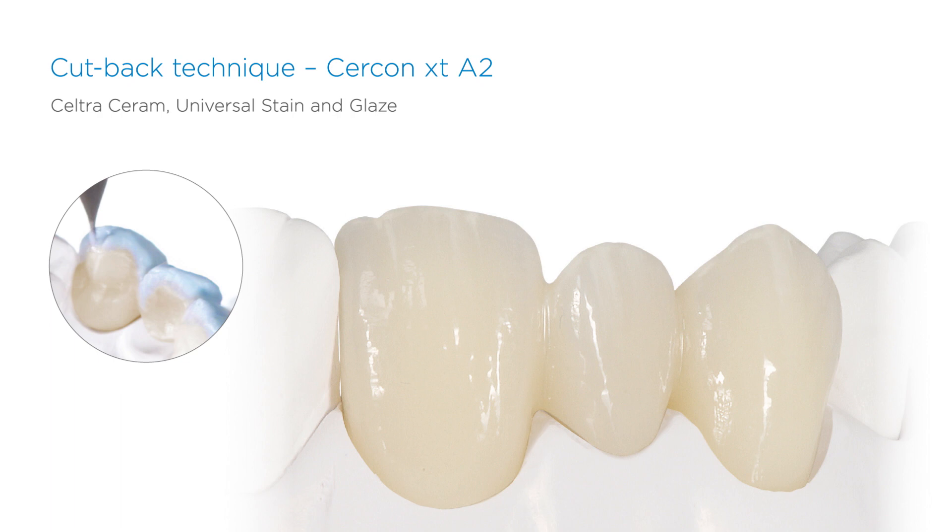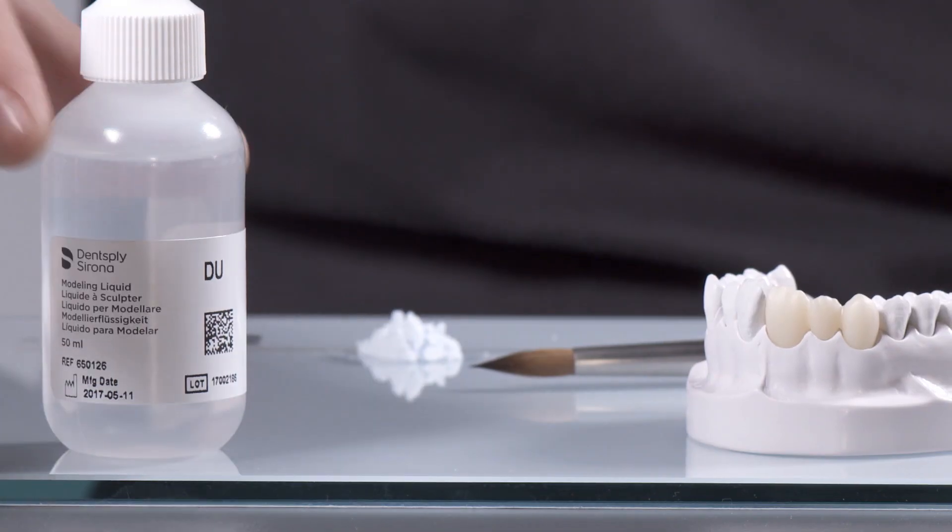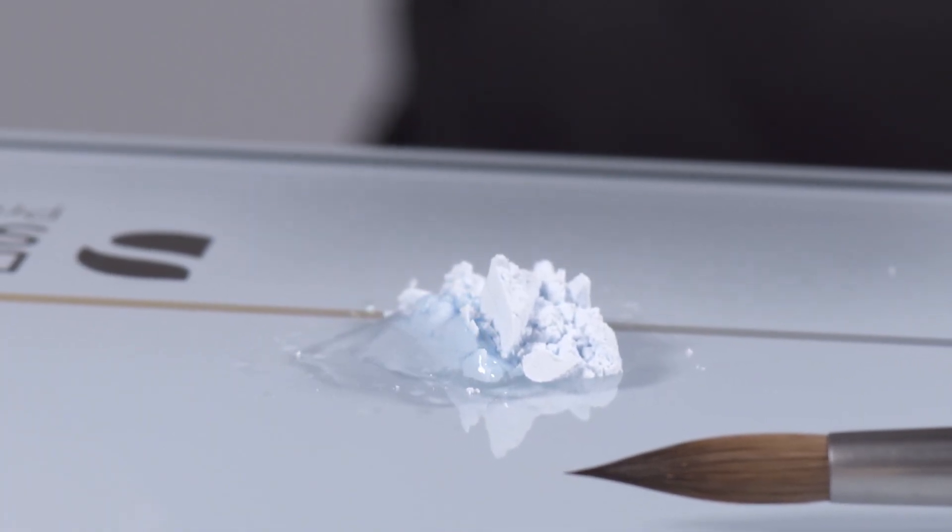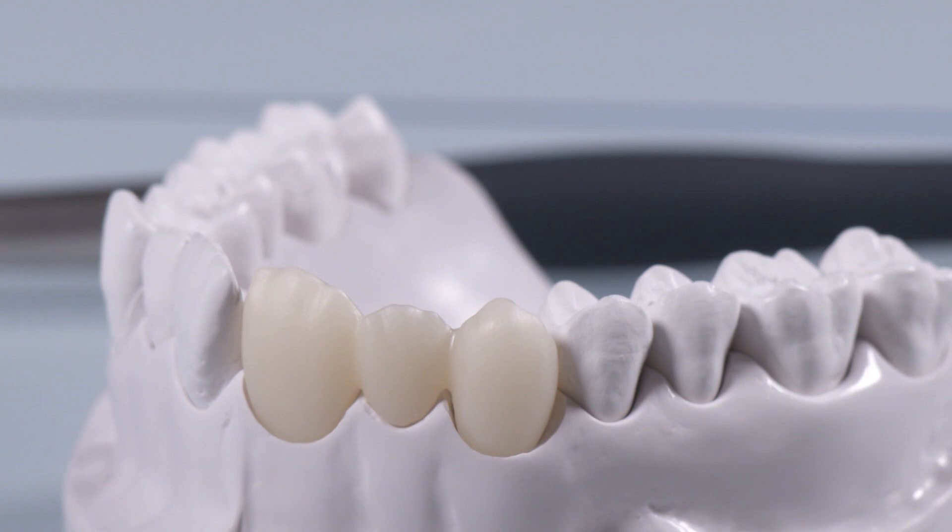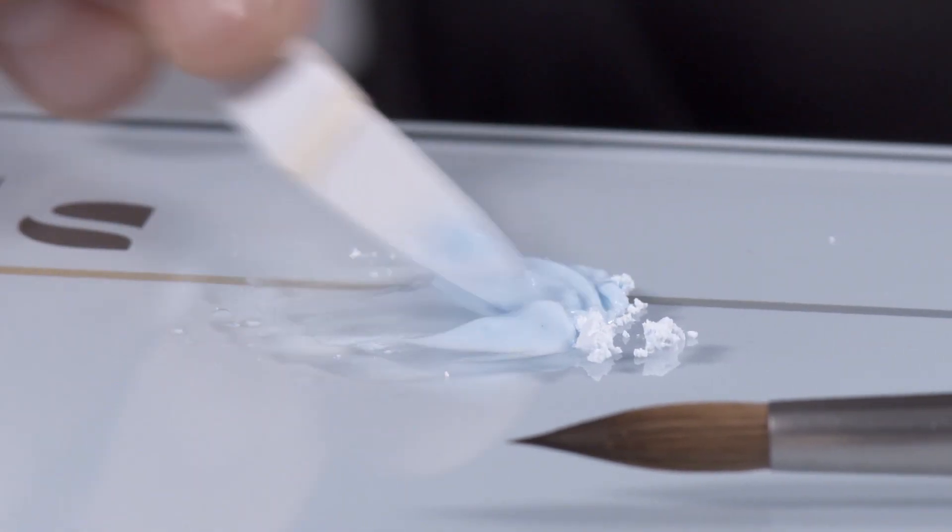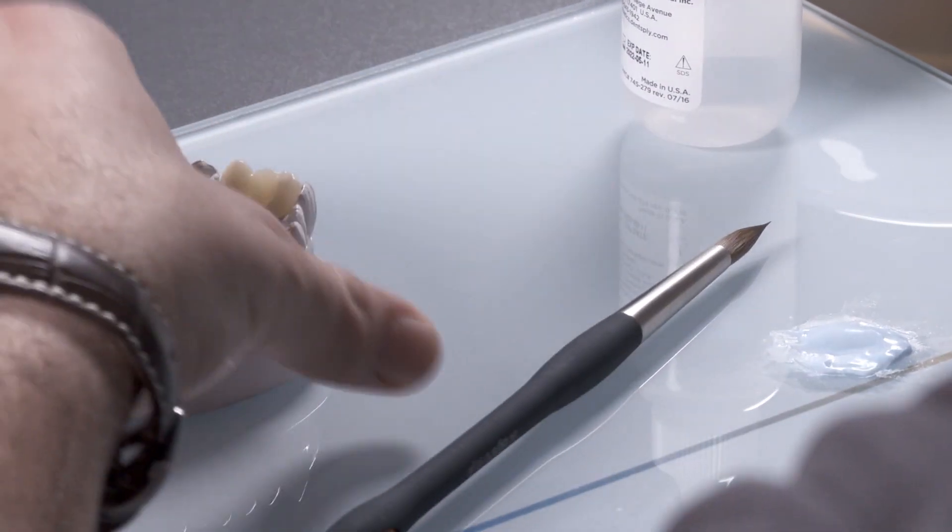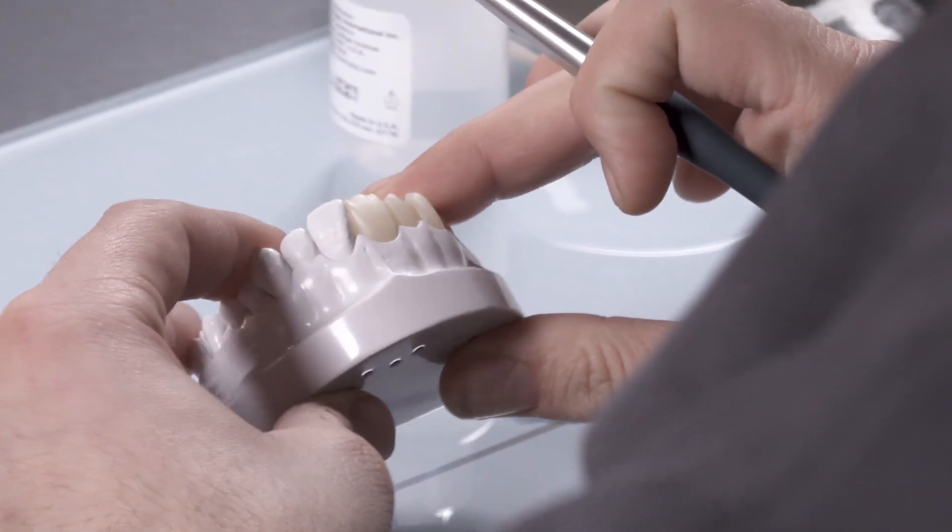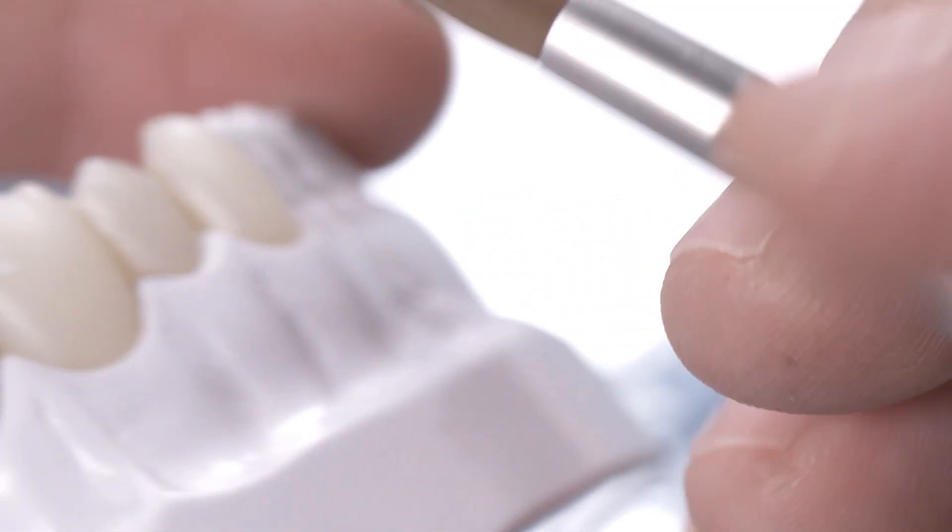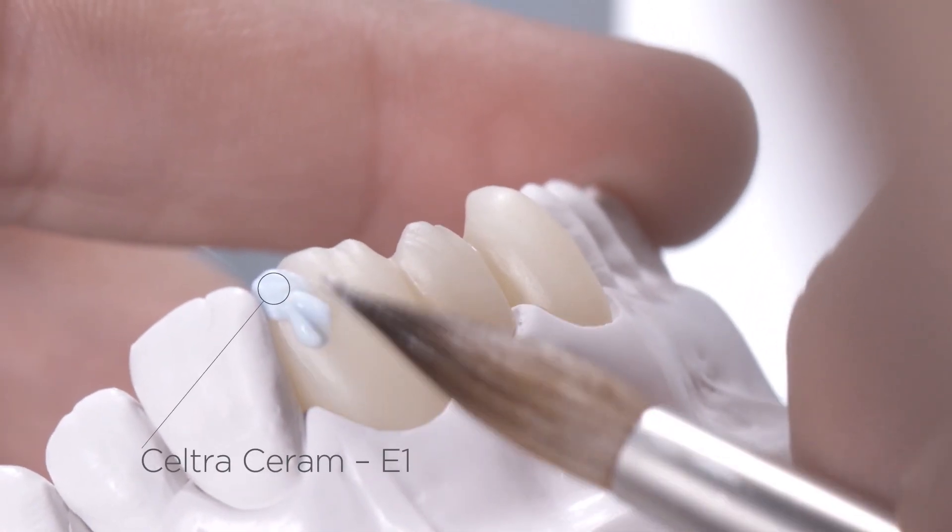The cutback technique and Circon XT offer an excellent opportunity to further improve aesthetics by applying only one incisal material, namely Seltra Ceram Enamel Incisal E1. The Mamelon structures were created when designing the framework. Build up the labial and palatal aspects of the enamel layer with Enamel E1 and shape them to obtain their final contours.